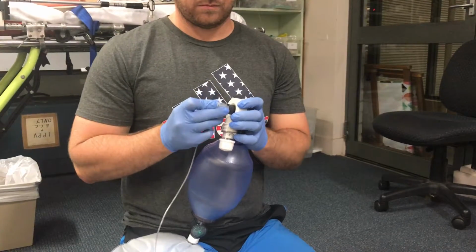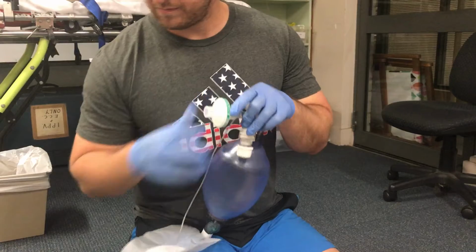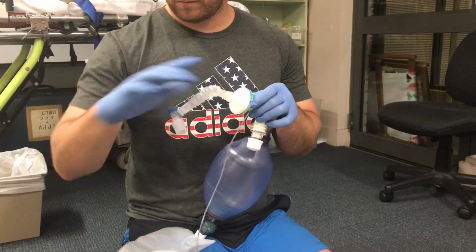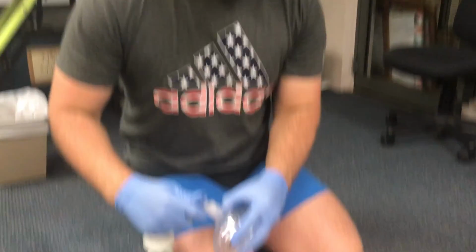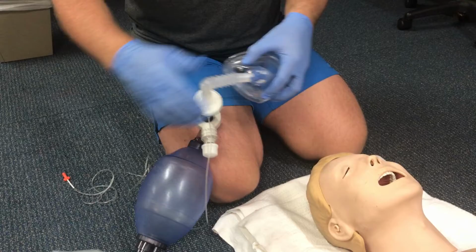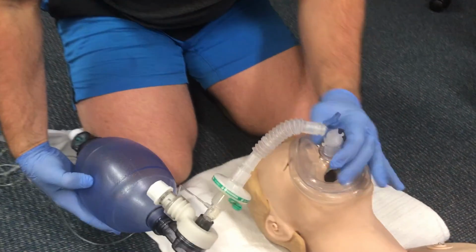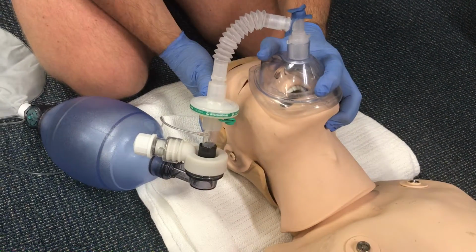Then attach my end-tidal CO2, bacterial filter, catheter mount, and then the face mask. I place the mask over the patient's mouth. To ensure an adequate seal, I place my thumb and index finger around the face mask and my 3 other fingers around the edge of the mandible, with the ends of my fingers up underneath the edge of the mandible to ensure an adequate seal. I look, listen and feel for rise and fall of the chest.